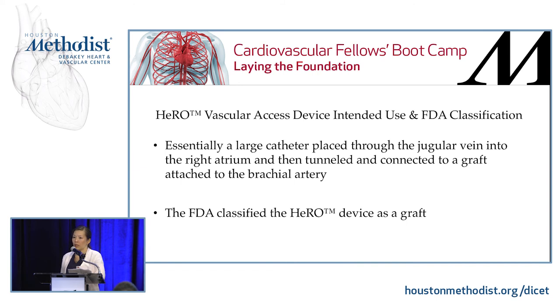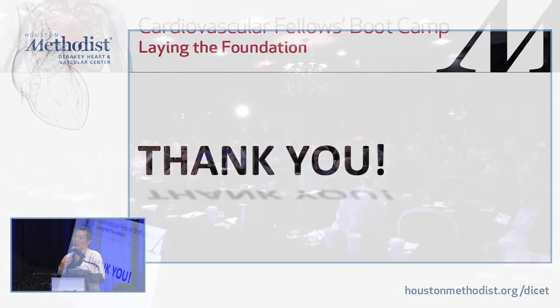We're part of a study called the Surfacer, where if you have an occlusion you can't get through with traditional means, we put a sheath through and we sort of puncture through the skin to get across the occlusion. And that's it.